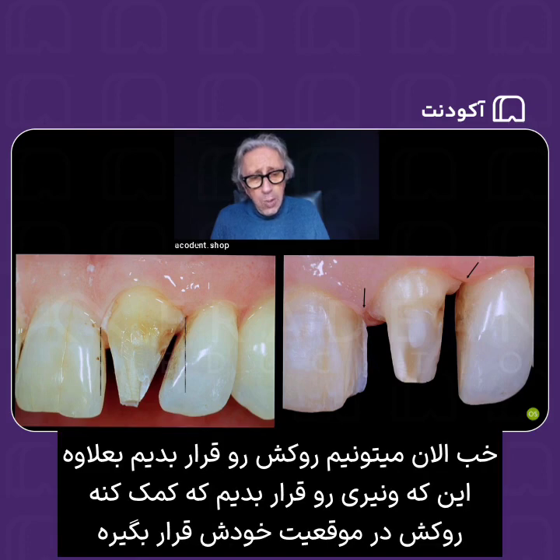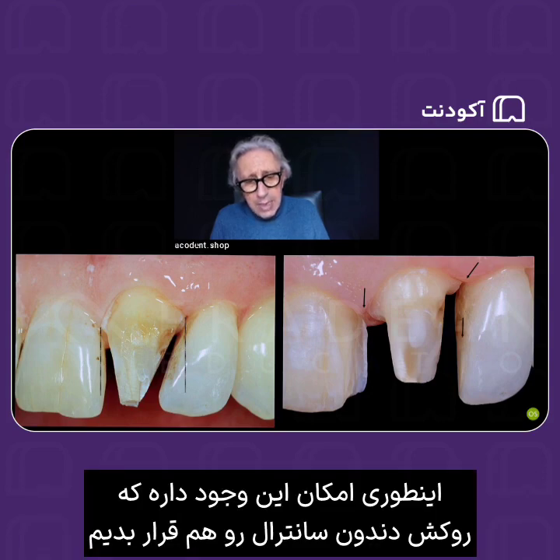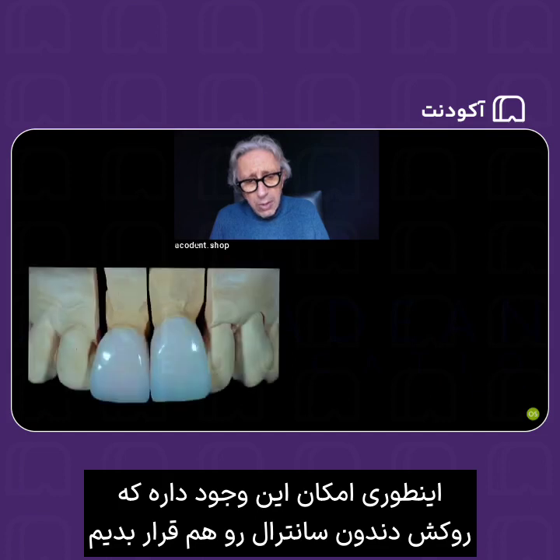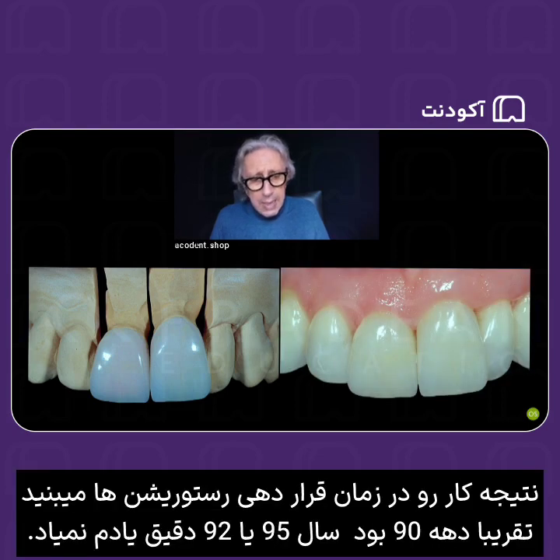So now we can insert this crown, plus you will insert a veneer that will help the crown to be positioned, because we have prepared, as you have seen, partially inside the body of the right central incisor. In this way, we have the ability to create a kind of possibility to insert the central incisor. So we see a crown on the left, a restoration that is a veneer on the right, and that's the result at the time of insertion.